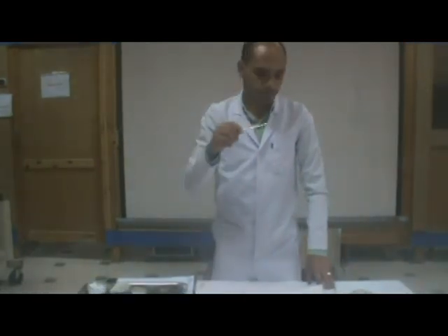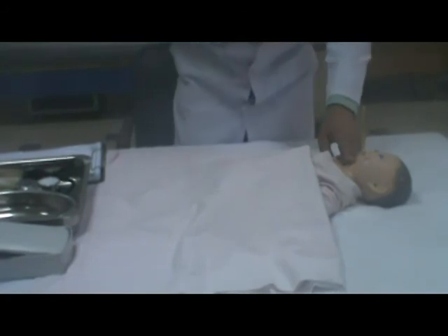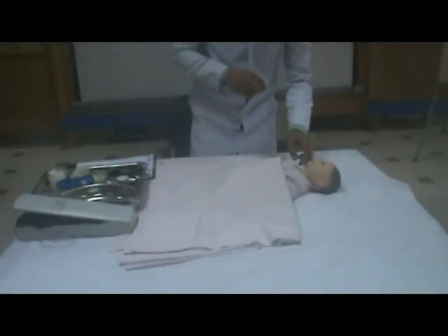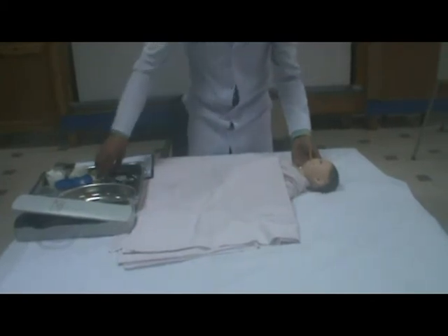Number 4, place the thermometer under the patient's tongue and ask him or her to close the lips without biting, as the highest oral temperature reading is at the posterior base of the tongue, which is least affected by environmental conditions. Number 5, keep the thermometer there for 5 minutes.